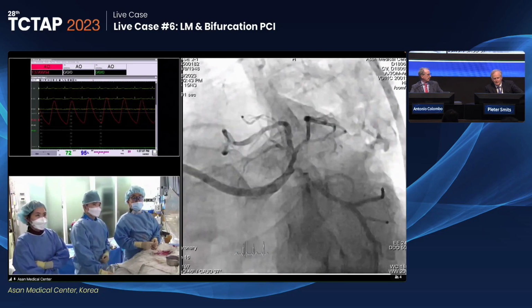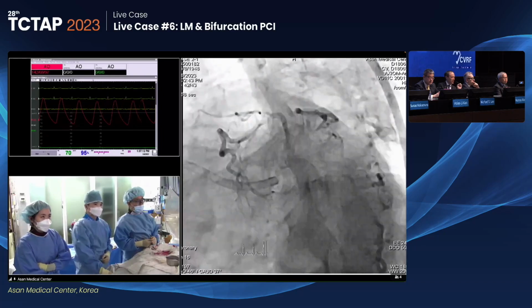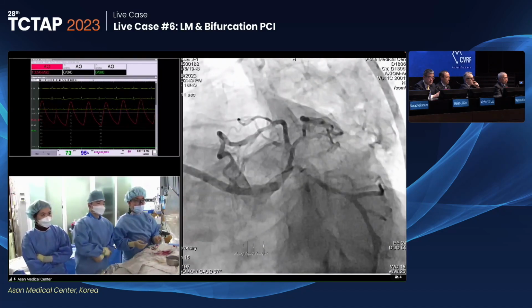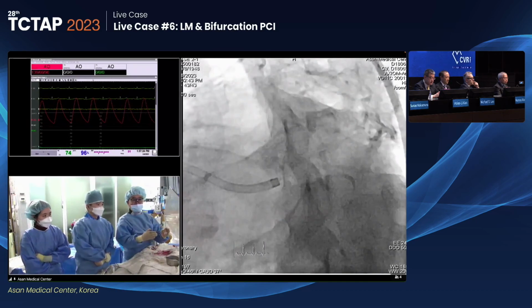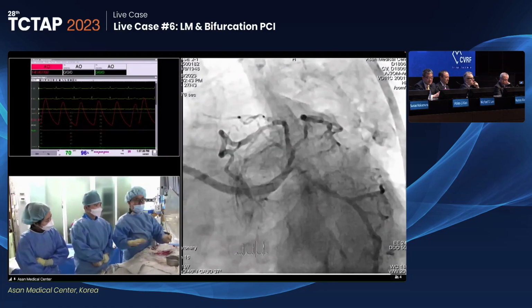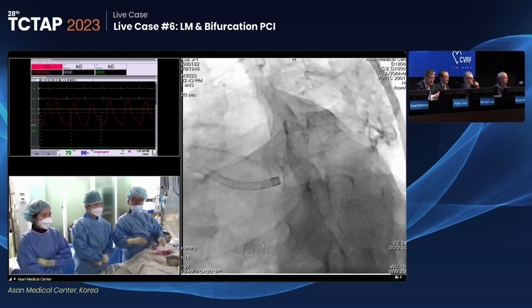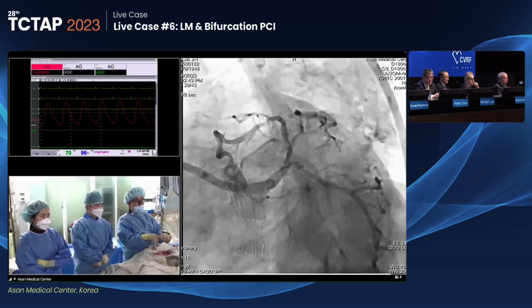Besides placing wires. Duk-Woo, hi, it's Michael Lee. Do we have intravascular imaging? Yes, already done. Is that available for us? Yes, okay. So we are going to show it, but before starting the IVUS evaluation, this is by visual estimation. In many countries we do IVUS evaluation in every case, but in many European countries and the US, imaging-guided PCI is still overall less than 20%. So it is just looking at the angiography, how do you do it?